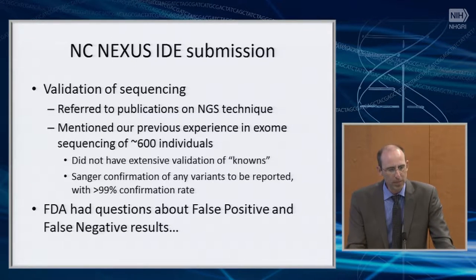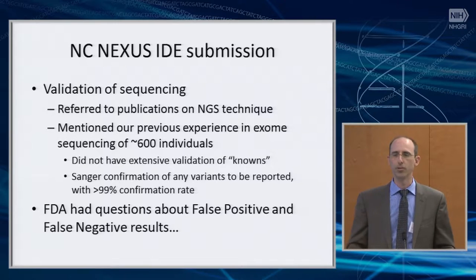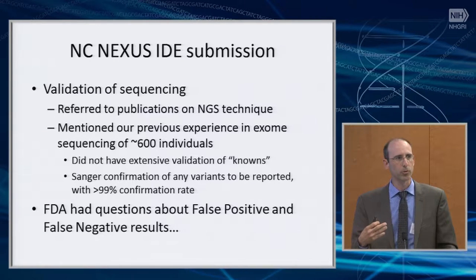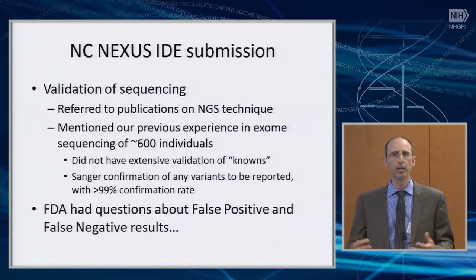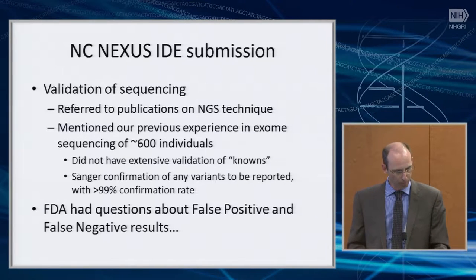So that was what was contained in that stack of papers. And, you know, I think in terms of the validation of the sequencing, we really rely on a lot of prior publications from our group and others. You know, Stephen pointed to a very nice validation paper, and there have been lots and lots of them. I'll show you a few. And so, from our interactions with the FDA, to what extent could one rely on the community's validation of all of these tools in a variety of different settings, or how much of that had to be actually validated within your own setup? Those were some of the questions that we had.